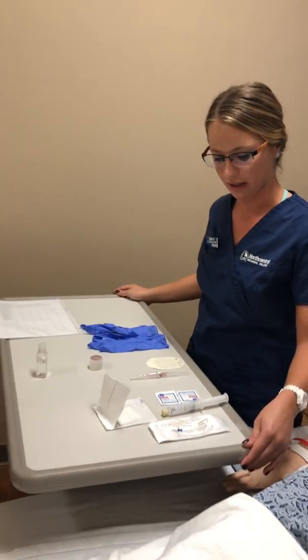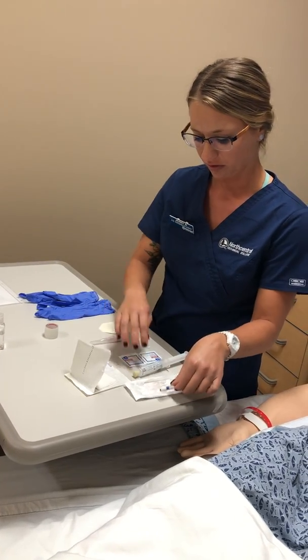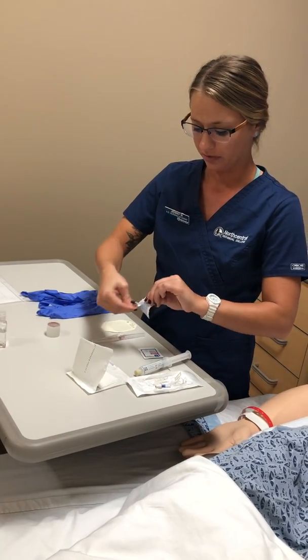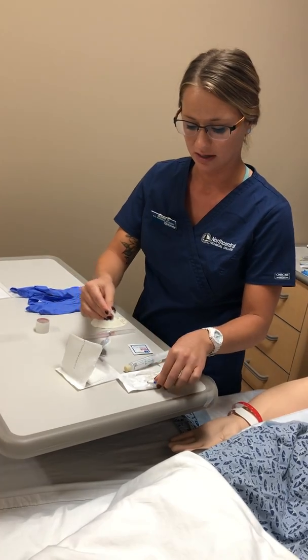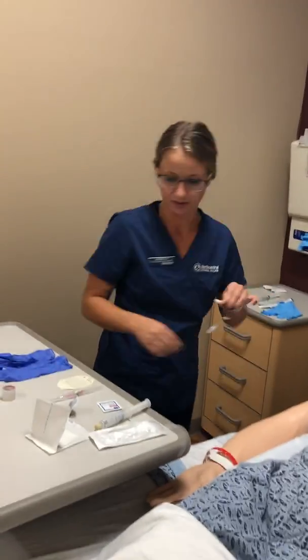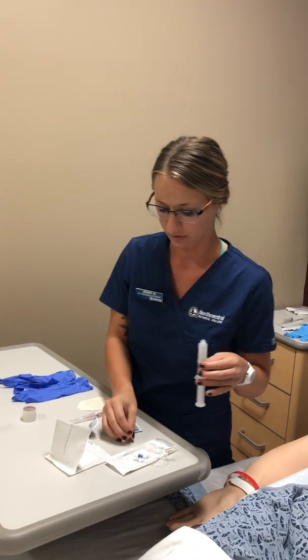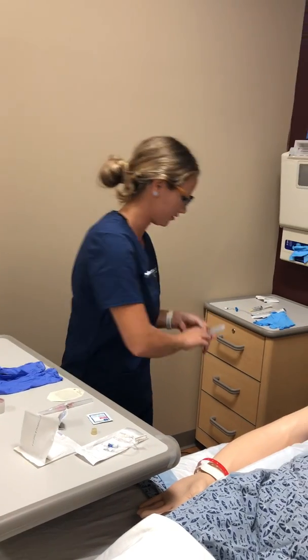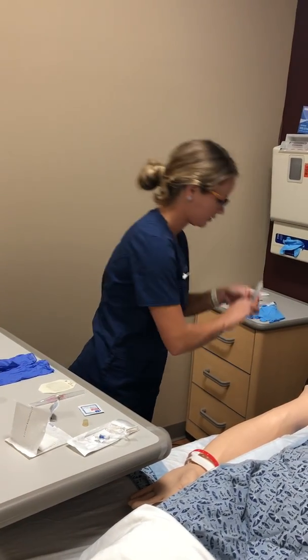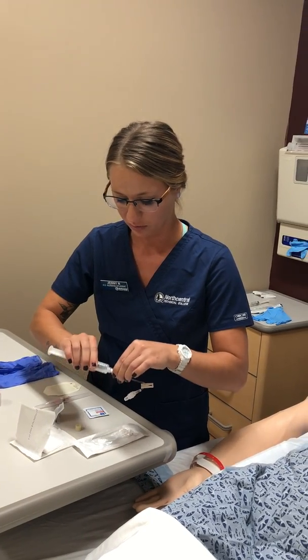I'm just going to prepare my needle and my saline lock. So first what I want to do, I'm just going to cleanse my saline lock, the port at the end here. Clean that. And I have a saline flush, 10 ml saline flush. I'll just make sure there's no air bubbles. Looks good. And I'm just going to attach that to my saline lock.